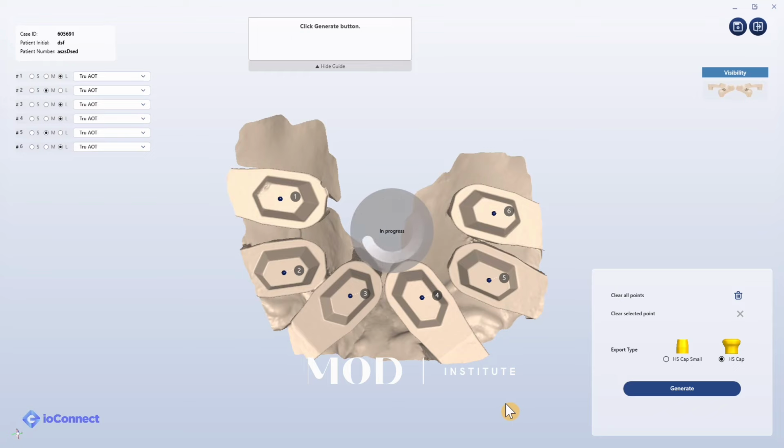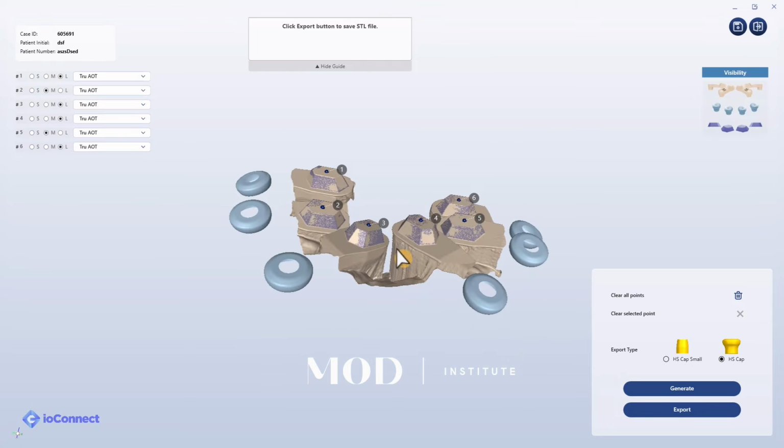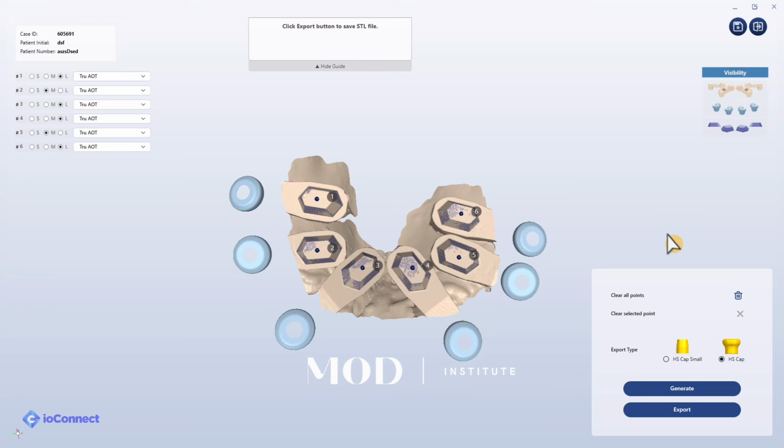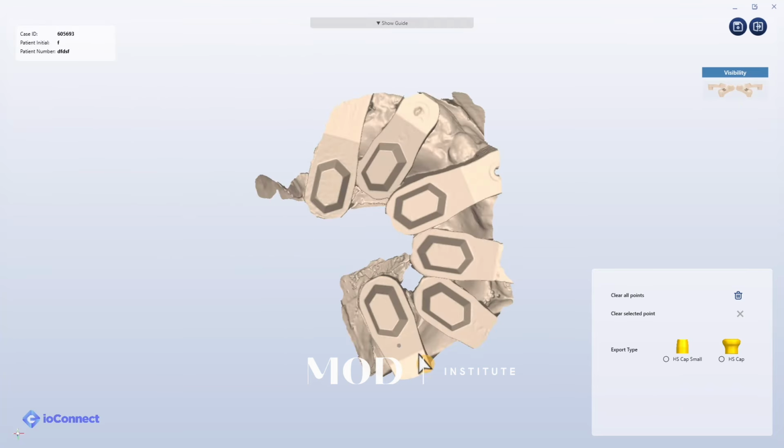And it's going to then export the scan body scan just like that. And you can see how much wider that is compared to the hexagon scan. That's shrinking the arch form. And you export that as an STL. And so let me explain what happens in the laboratory software after this.